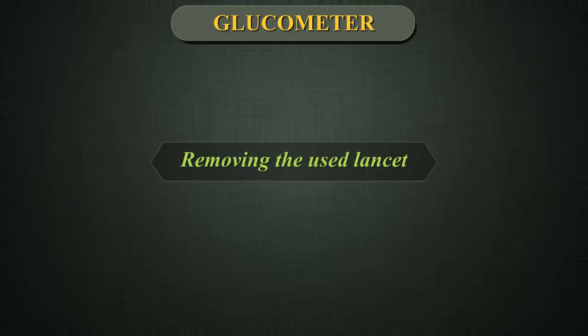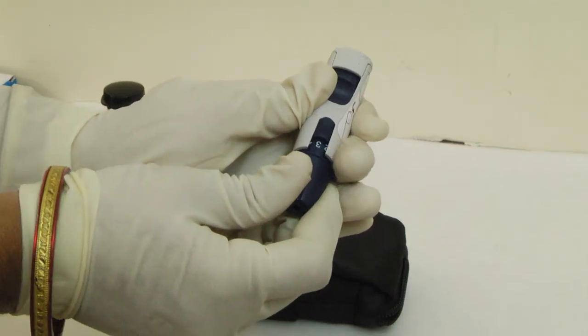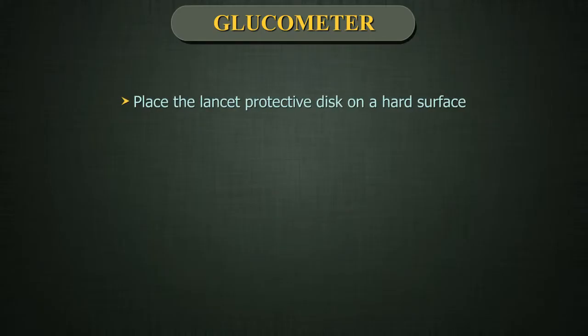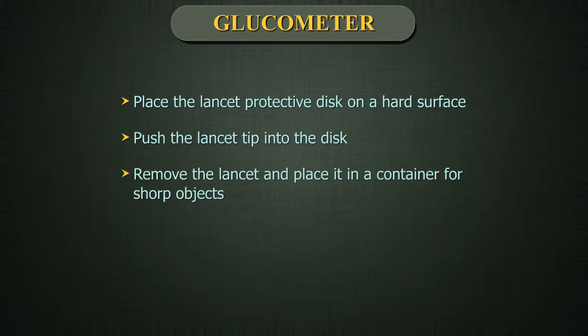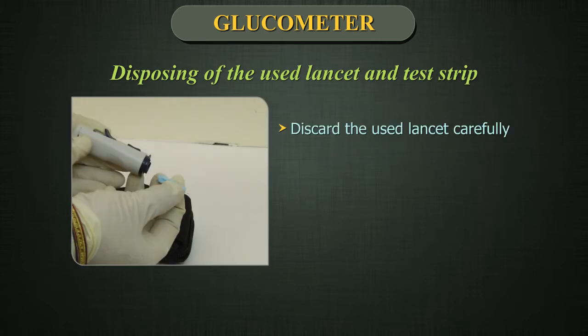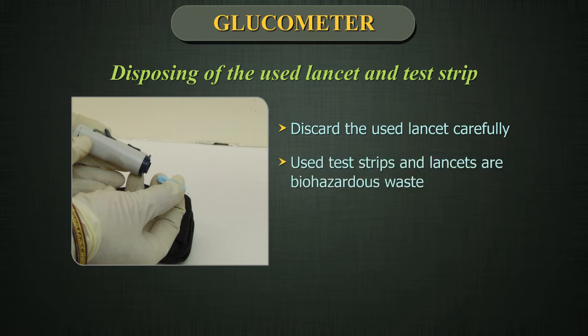Removing the used lancet. Remove the lancing device cap by snapping it off. Cover the exposed lancet tip before removing the lancet. Place the lancet protective disc on a hard surface. Push the lancet tip into the disc. Remove the lancet and place it in a container for sharp objects. Replace the cap. Disposing of the used lancet and test strip. It is important to discard the used lancet carefully after use to avoid unintended lancet stick injuries. Used test strips and lancets are biohazardous waste. Be sure to follow your local regulations for proper disposal.